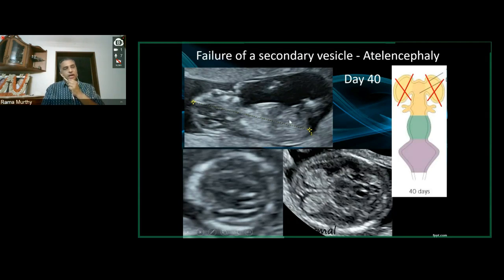And it was a difficult case, so we said we will go transvaginal. On transvaginal scan, this is what I saw as far as the fetal cranium goes. It's an axial section. You see the two cerebral peduncles, and they are the cerebral peduncles because they sandwich the aqueduct of Sylvius, very clearly seen. And the cerebral peduncles are contiguous with the thalami. So you see the two thalami here.